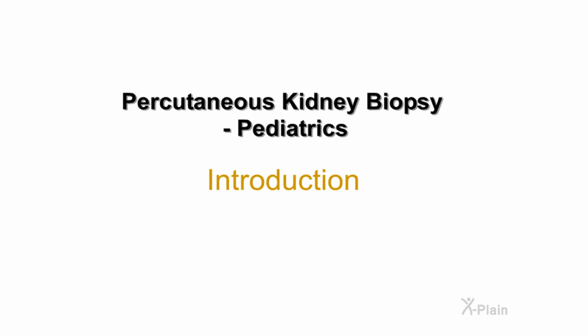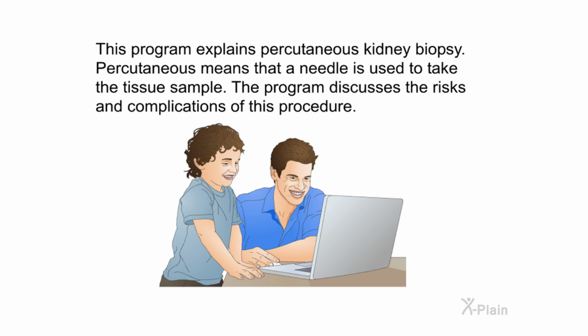Percutaneous kidney biopsy. Pediatrics. Introduction. This program explains percutaneous kidney biopsy. Percutaneous means that a needle is used to take the tissue sample. The program discusses the risks and complications of this procedure.